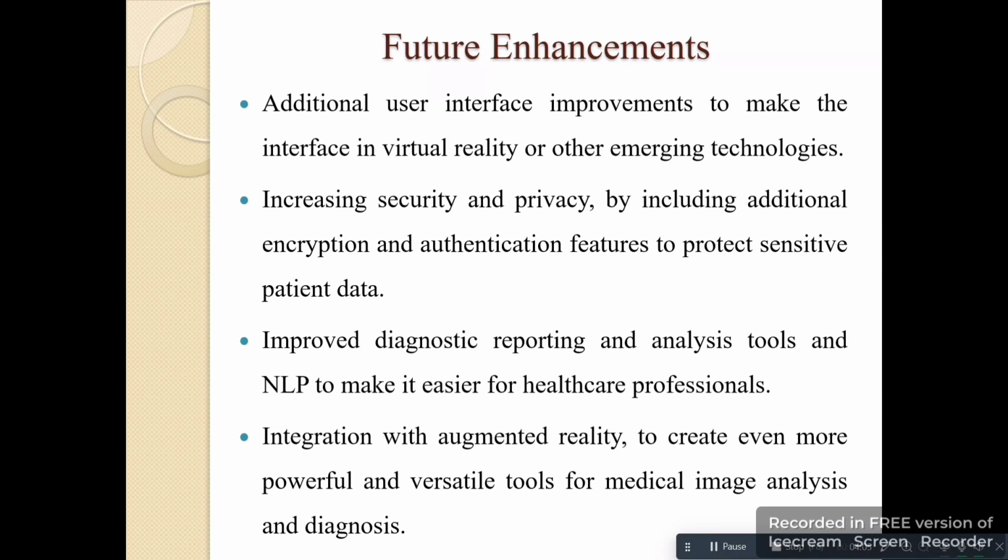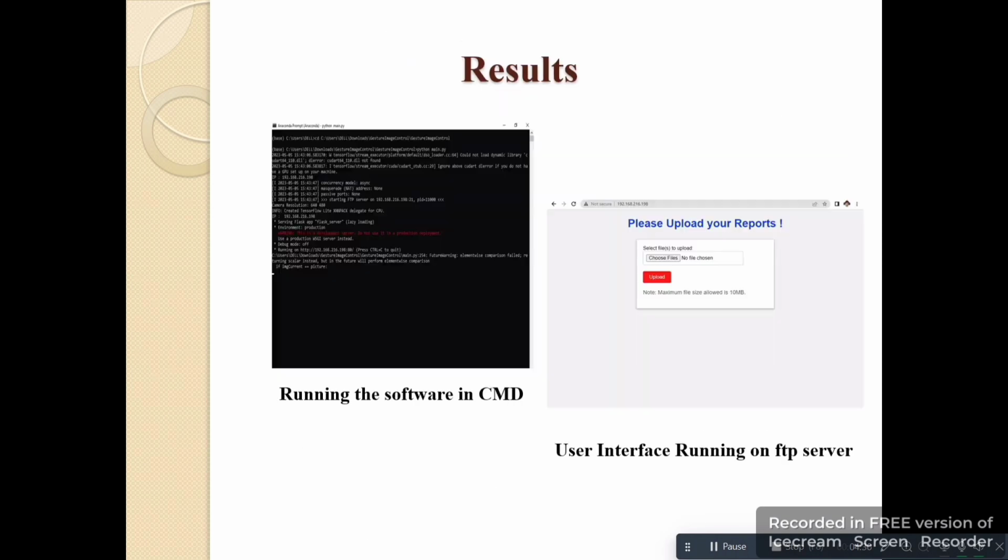Future enhancement. Additional user interface improvements to make the interface work in virtual reality or other emerging technologies. Increasing security and privacy by including additional encryption and authentication features to protect sensitive patient data. Improve diagnostic reporting and analysis tools and NLP to make it easier for healthcare professionals. Integration with augmented reality to create even more powerful and versatile tools for medical image analysis and diagnosis.